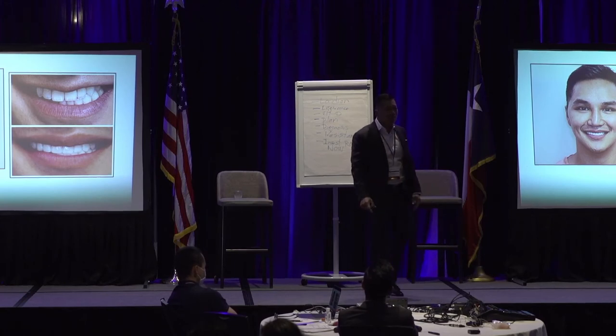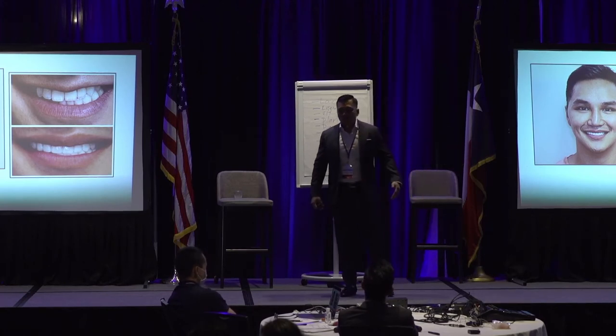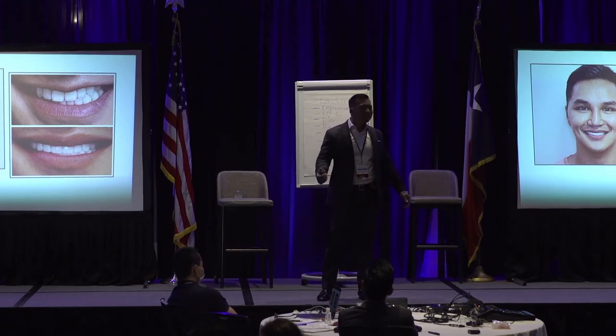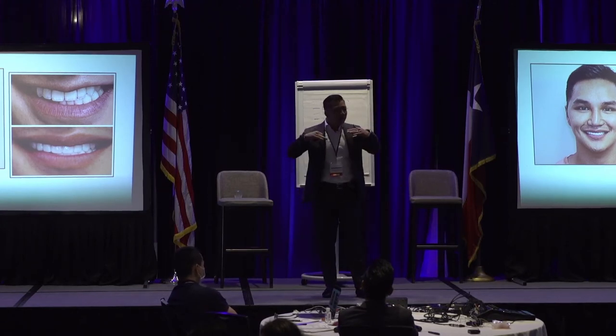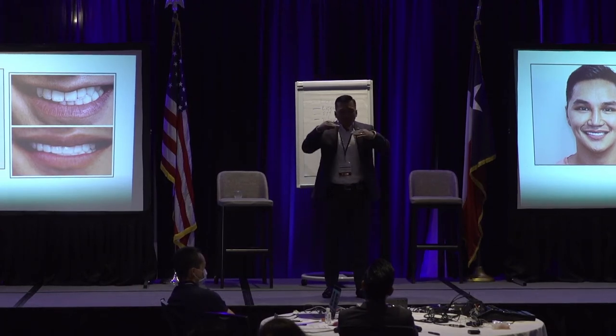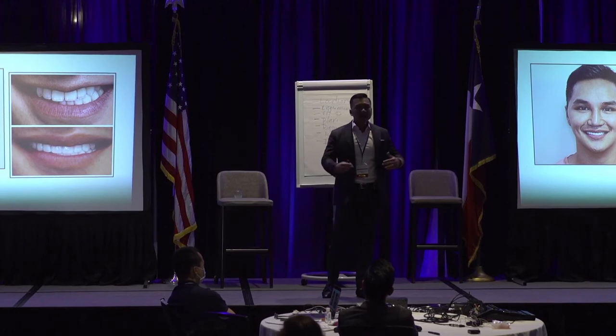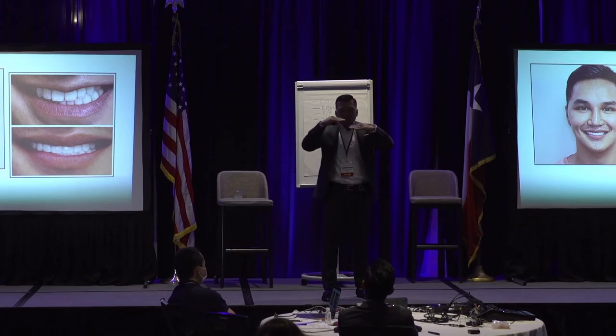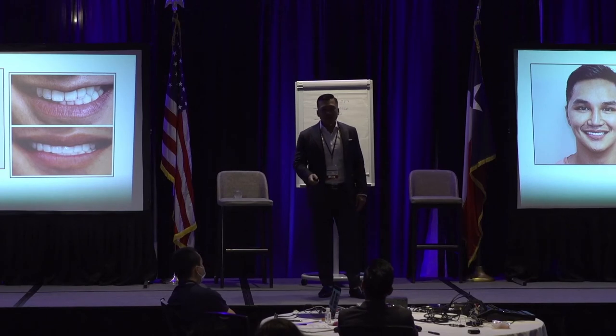So that's why labs tell you to do the face bow, but even the face bow moves. In residency, none of us did a face bow right. It always moved, and we mounted all of our cases in residency. It's how I learned a lot of these processes, but it moves just a little bit. So the digital design process works as you're taking the intraoral scan and the face, and they put that together, and now you have your lip line, your incisal edge position, all of those things put together. Is that making sense? I know this is confusing at first, but hopefully I'm getting better at explaining this.